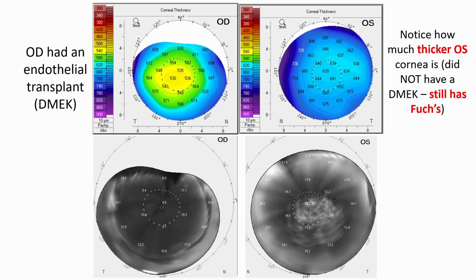I do like that particular example because that patient did have a DMEK combined with cataract surgery, like we can see in the right eye. The densitometry looks much clearer. The pachymetry is much more normal. The left eye is the one that she had a little remorse not doing the DMEK also. Pachymetry is swollen and densitometry is opaque.